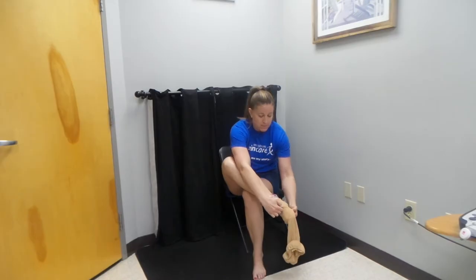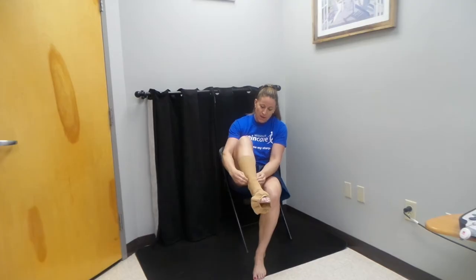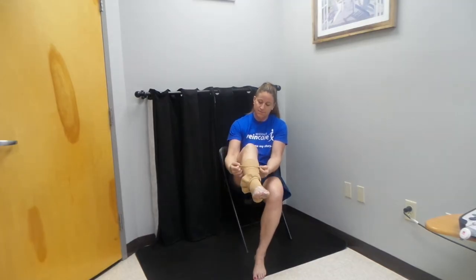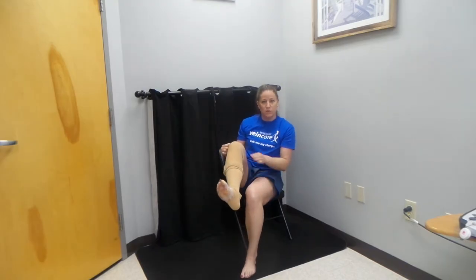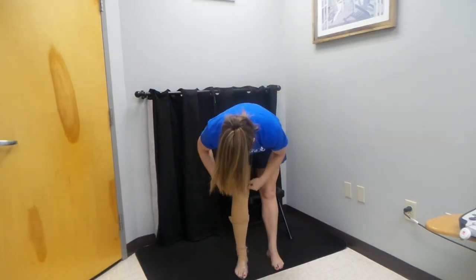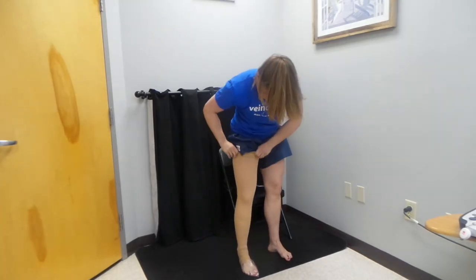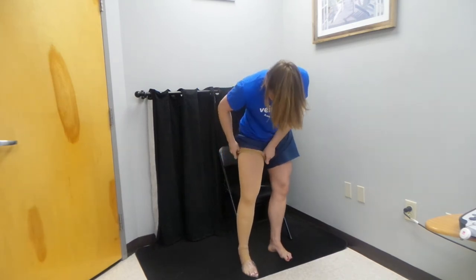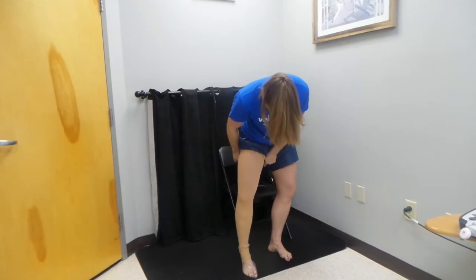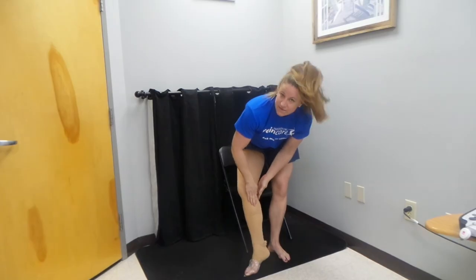Now we're going to work the stocking up the leg. Starting from the bottom, just little by little, we're going to pull the stocking up towards the knee. If you notice, the heel is up here — that's okay, we'll get to it in just a second. We're going to stand up, pull the stocking up, and pull the thigh-high stocking all the way up, making sure it's nice and snug at the top and that there aren't any creases.